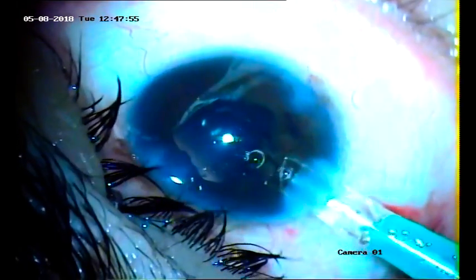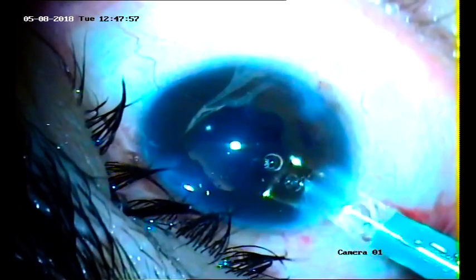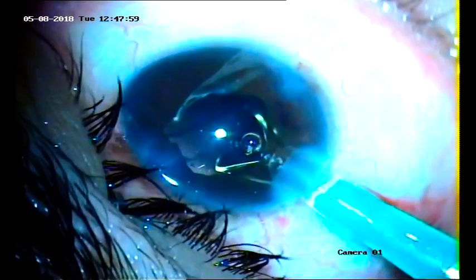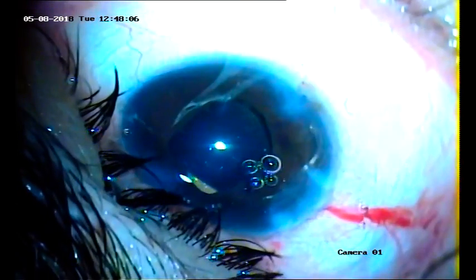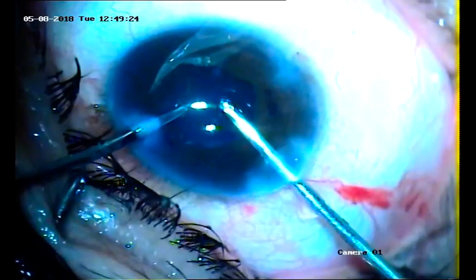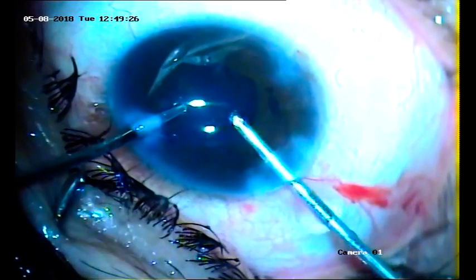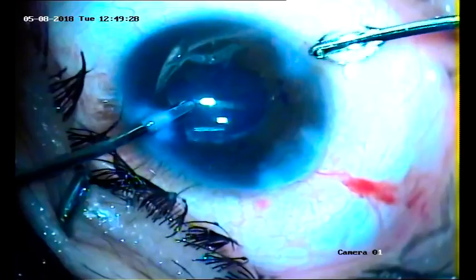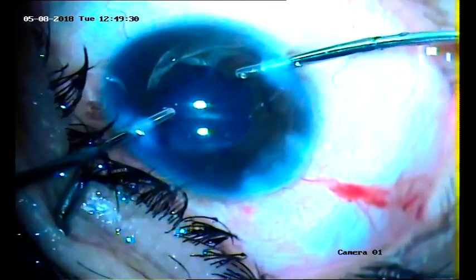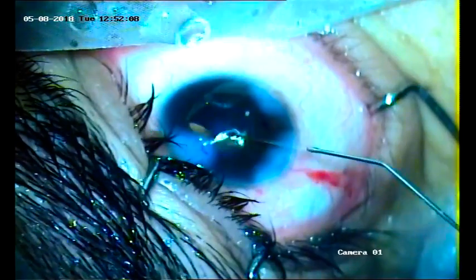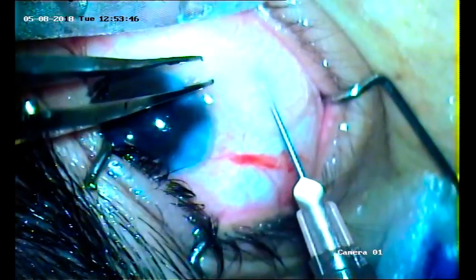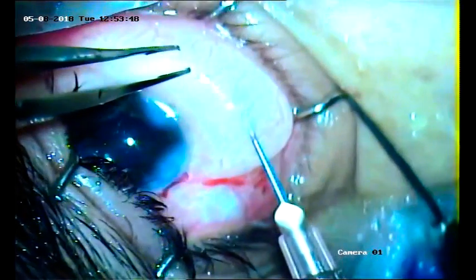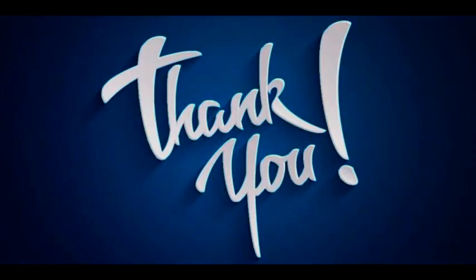Now the IOL is implanted — a hydrophobic acrylic IOL is used; a hydrophilic acrylic IOL can also be used. A one-piece IOL with in-the-bag placement is mandatory. Subconjunctival Dexa-Gentamicin was given. Preoperatively we started with steroids, and again postoperatively, steroids have to be maintained aggressively. Thank you very much.